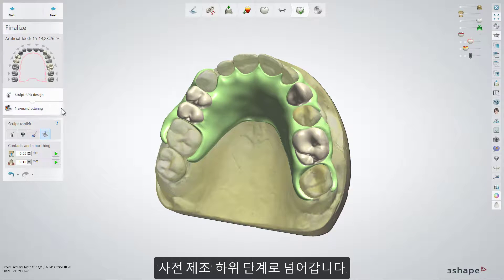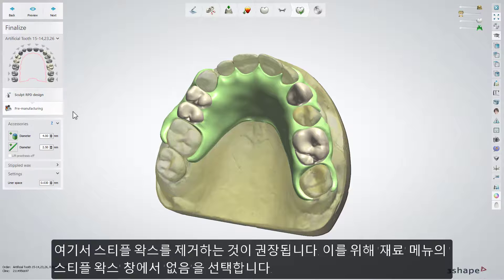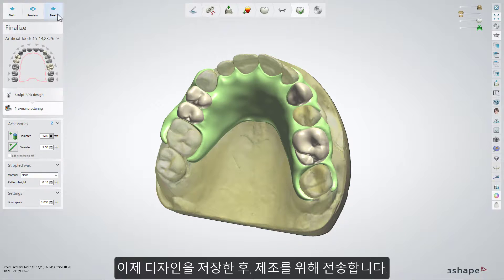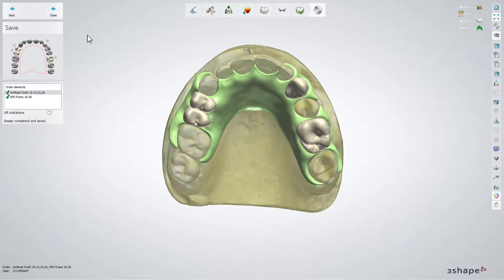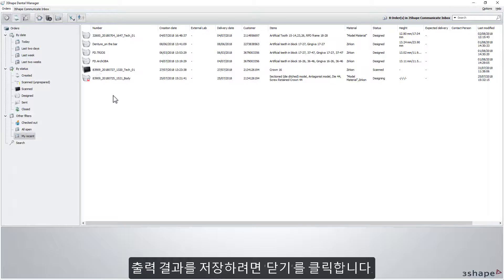Now go to the pre-manufacturing sub-step. It is recommended to remove the stippled wax. From the material menu, in the stippled wax window, choose None. Now you can save the design and send it for manufacturing. Click Close to save the output result.